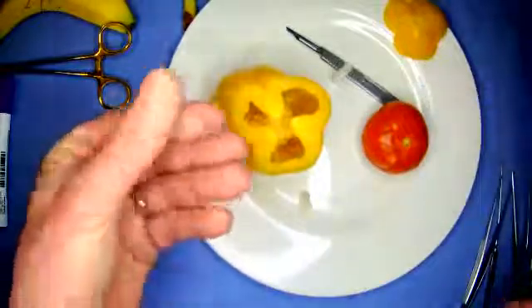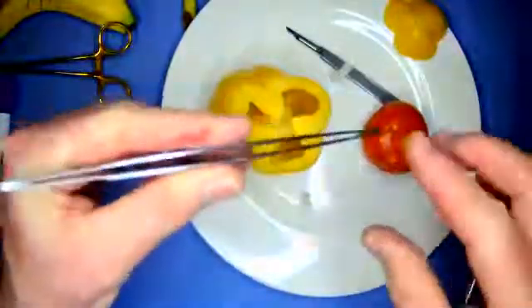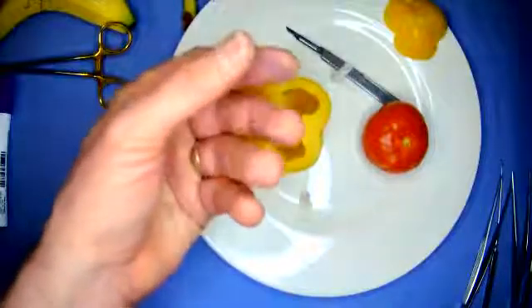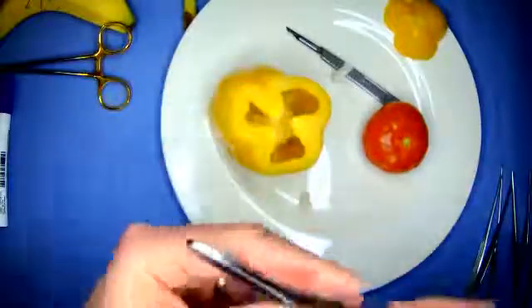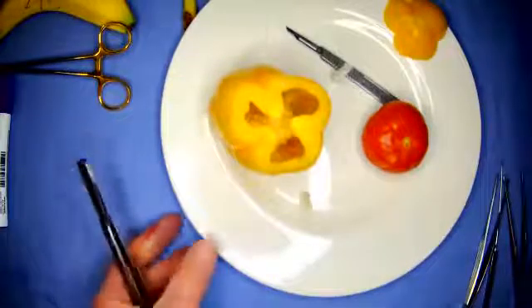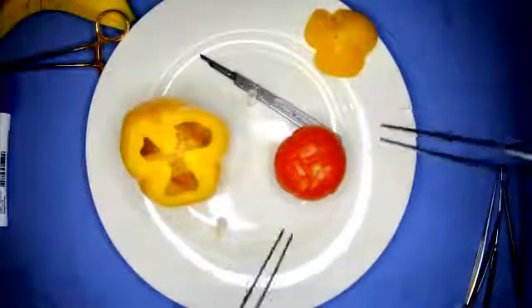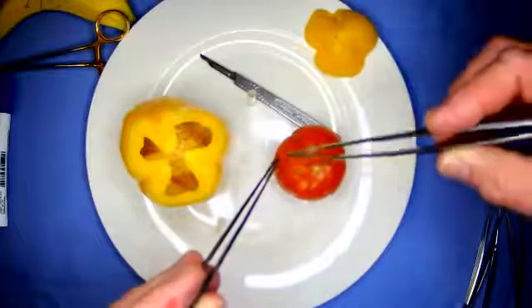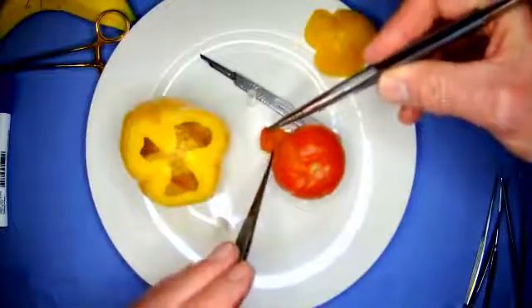And forceps, you've got to remember, should be an extension of your fingers. Yeah? All they do is an extension of your fingers. And actually, many colleagues, when doing cardiac surgery, would insist on holding the vein or radial artery between their fingers because they're well aware of the problem of grabbing. So what I've done here is another model. Just to show you delicacy, I've boiled a tomato. And what we want to do here is delicately peel off the skin of this tomato without tearing it.